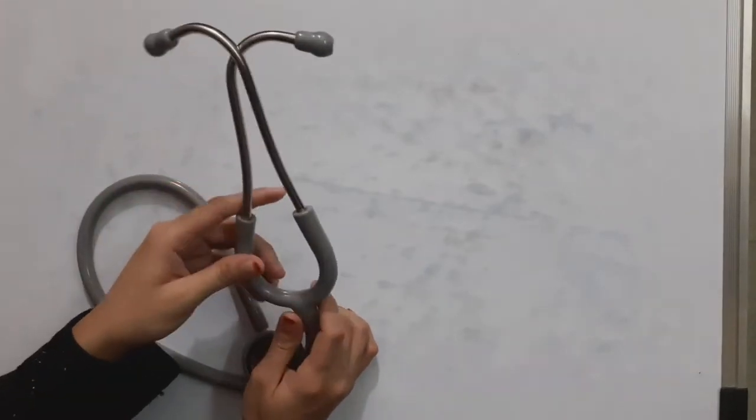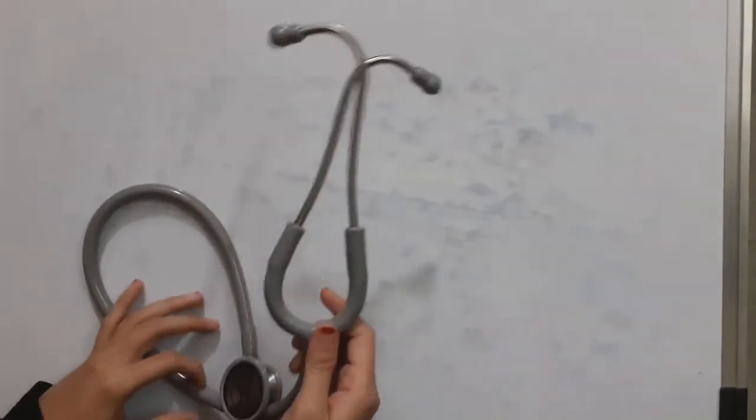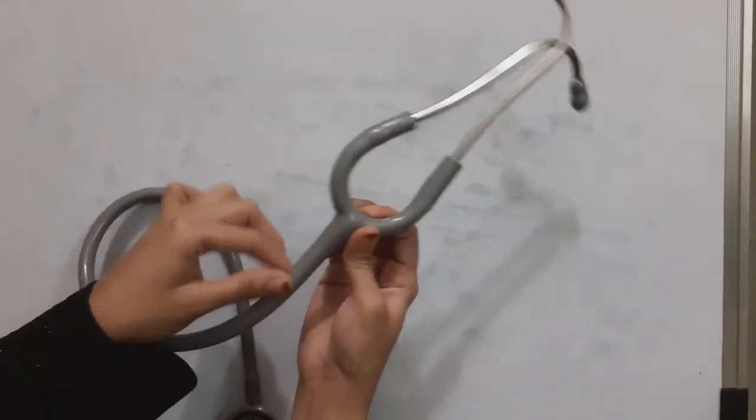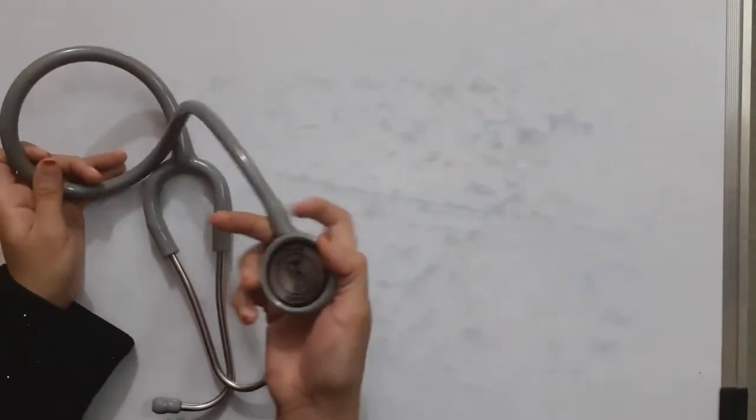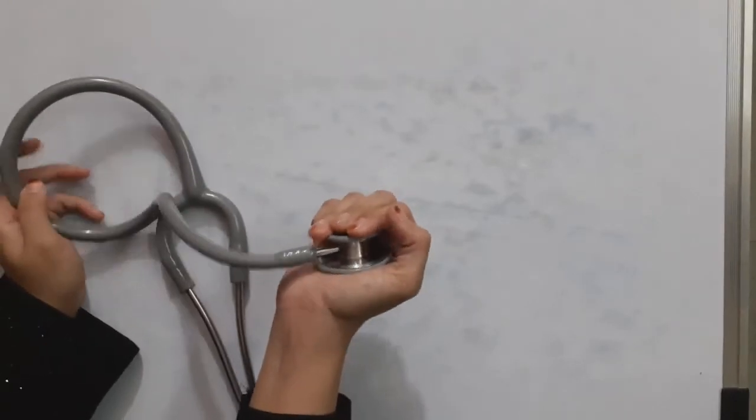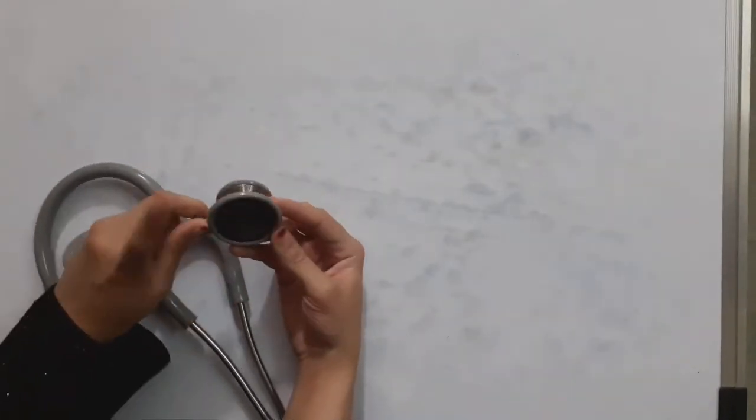Then there's the binaural spring and rubber tubing. This entire piece is called the chest piece, and it has the bell and the diaphragm.